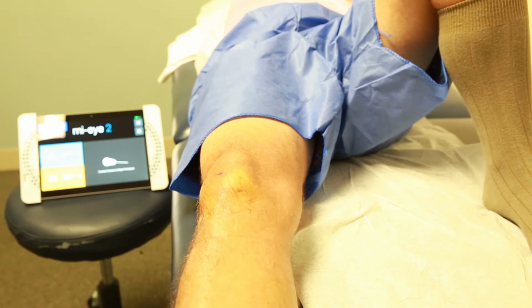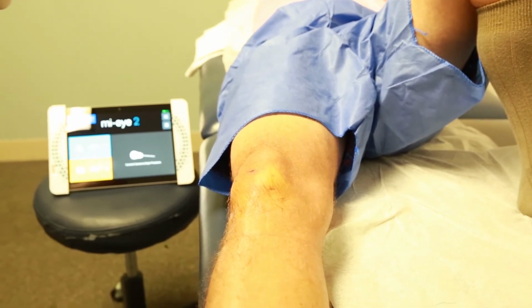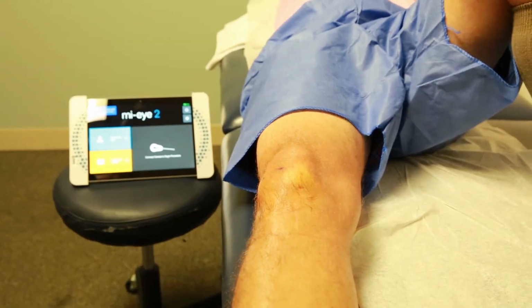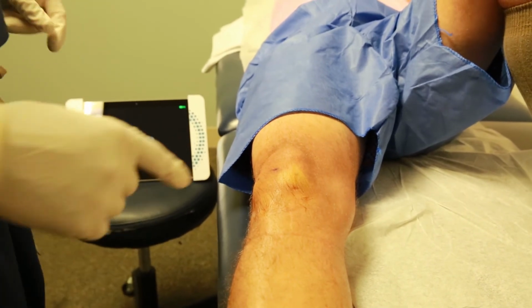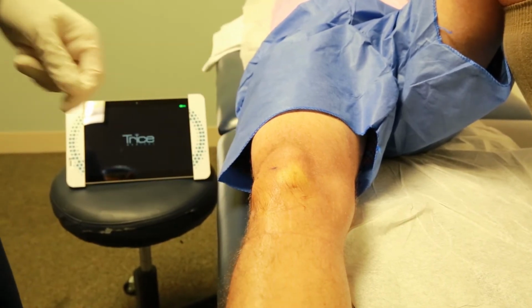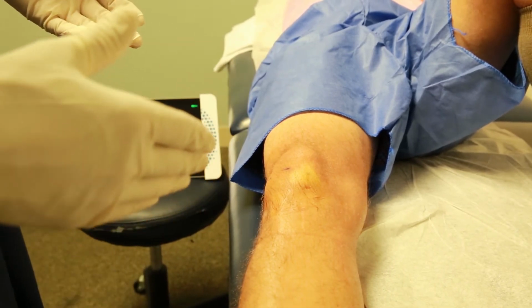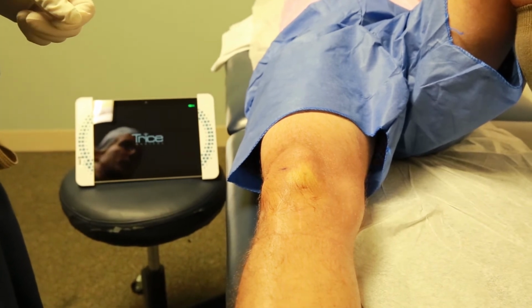So after we do the injection, what is the optimal time to wait to do the procedure? I usually end up waiting between 5 and 10 minutes because I'll usually inject the patient, let them relax, go see another patient, and then I'm ready to go. When I come back, you'll often see what we see here. You'll see the white blanching caused by the epinephrine. So then I know that that's taken effect. We have decreased blood flow. Most likely the lidocaine is now taking full effect and he's not going to feel anything.